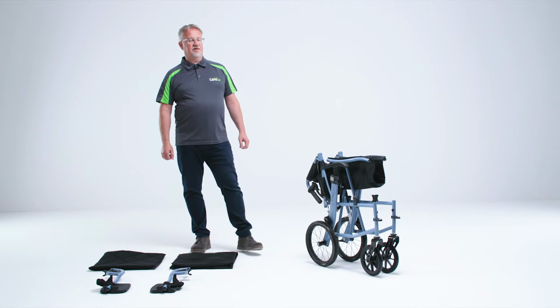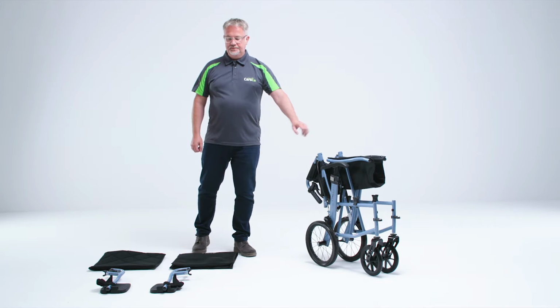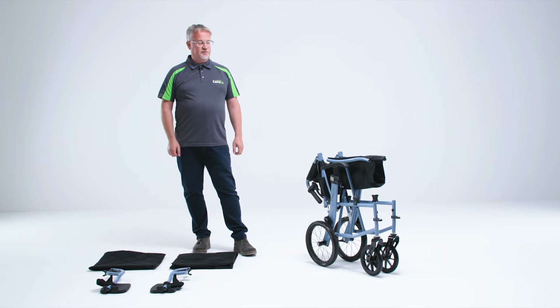We're going to put together the Edge wheelchair. Once you've taken all the parts out from the box, you've got the main wheelchair itself, you've got the footrests, and then you've got the backrest and the seat pad. So let's put them together.